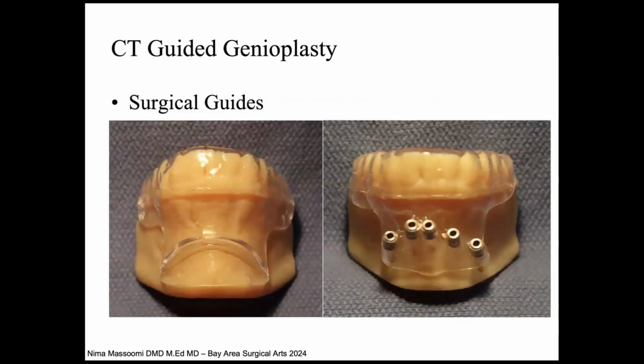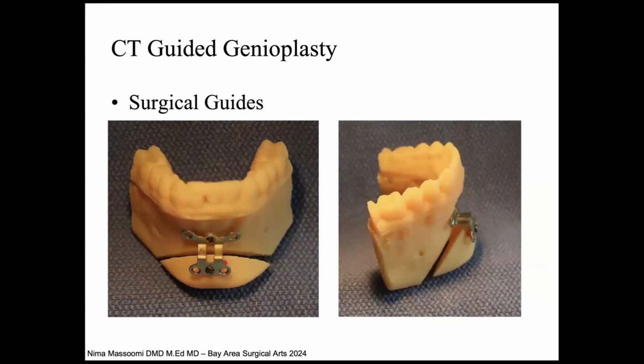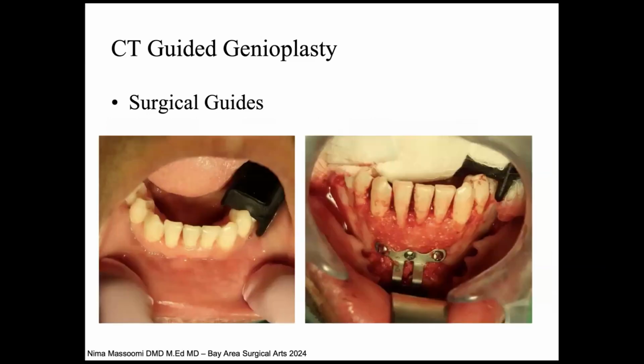And after that, I was like, well, geez, can we use that same method? Can we start doing cosmetic surgery? So then I started doing CT guided genioplasty. With the team at Anatomage back then, now osteoid, we created surgical guides that fit on the teeth. That's almost like a template for us to make the genioplasty. These are some of the models showing that we want to move this patient's chin 6 millimeters forward, and you can see from the plates that this is a 6 millimeter genioplasty plate that we put on. And this is just some of the clinical intraoperative photos.